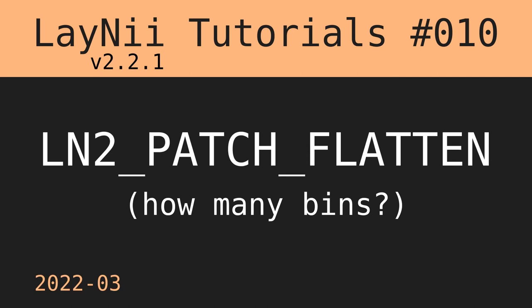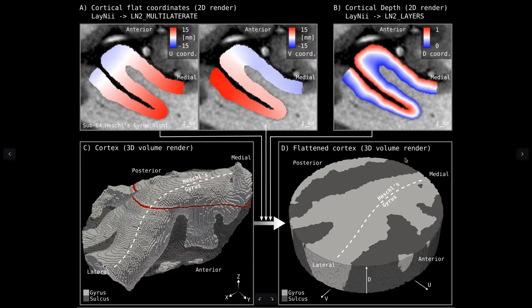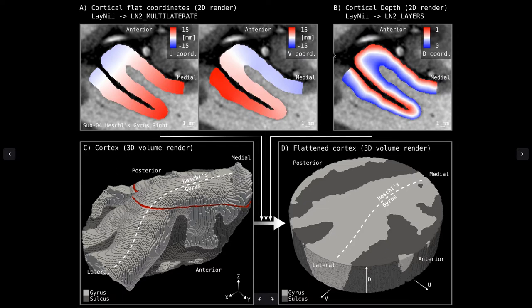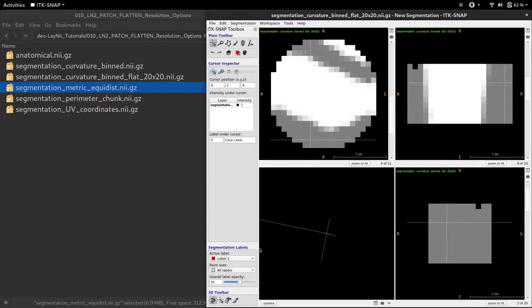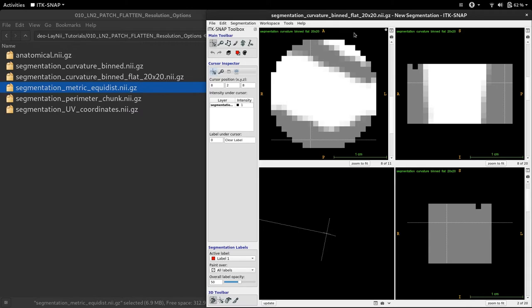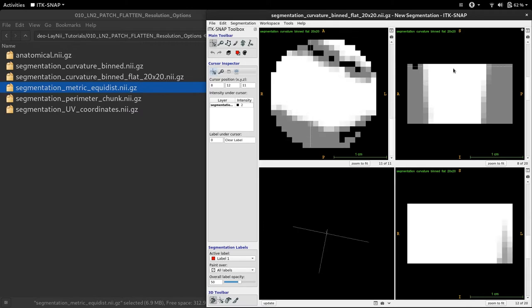Hi, in today's video I'm going to talk about how to decide on how many bins we want to have using ln2 patch flatten. In the previous video, you can remember that we were using U and V coordinates computed by ln2 multilaterate together with the depth coordinate computed by ln2 layers to do the transformation from the folded brain to a flat representation by using ln2 patch flatten. We had an example which used 20 by 20 bins to represent the cortical surface and 11 depths.